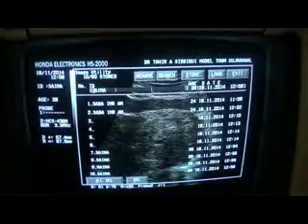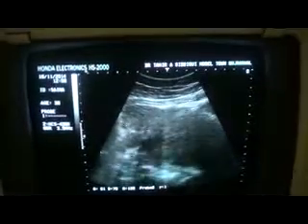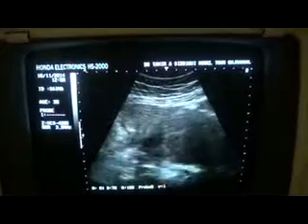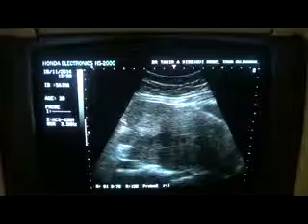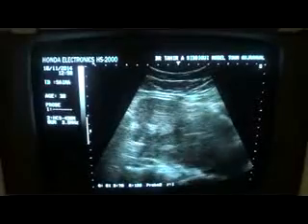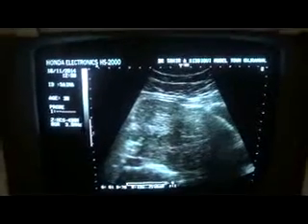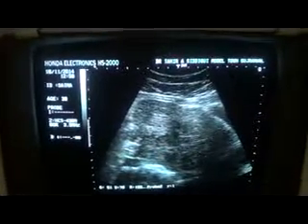So this is in fact a case study of uterine fibroid, elevating the uterus anteriorly and stretching it so that I am seeing it just at the level of the umbilicus in the midline, and the rest you can see it's extending and expanding. This is all fibroid, this is all fibroid.